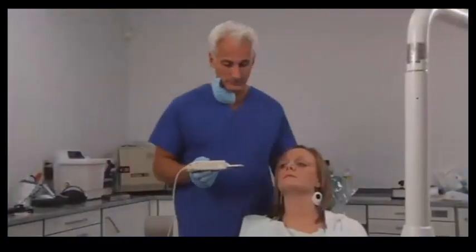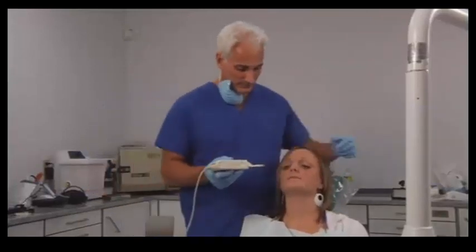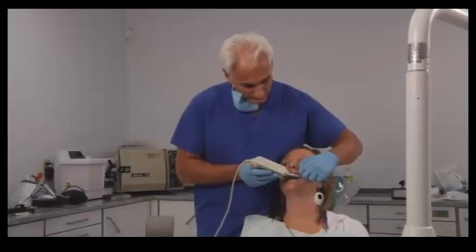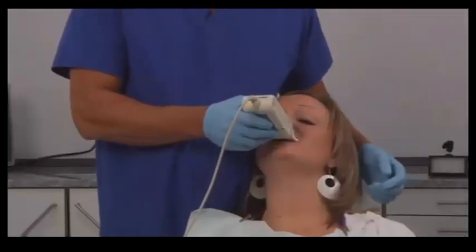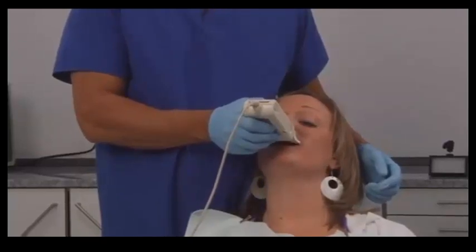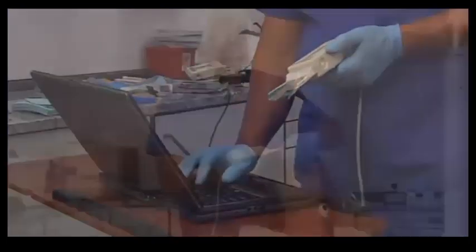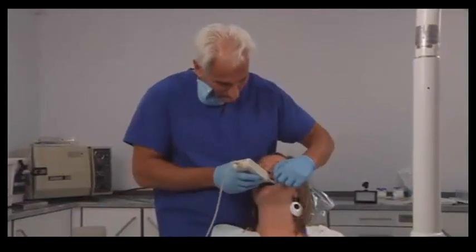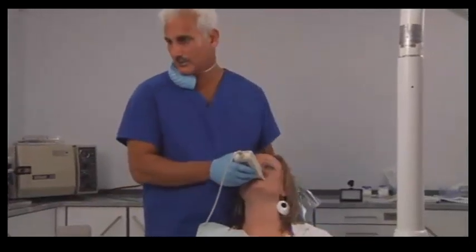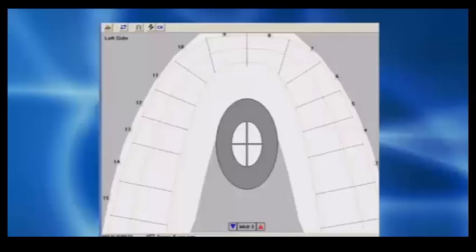Okay, Carolyn, we're going to re-record now, going right, left, and forward. Okay, put your head back. This will be to the right. Go ahead and bite down again. There we go. Open. Bite down again. Now go to the right. Good. Excellent. Okay, this time you're going to go to the left. Go ahead and bite down. Good. Open. Bite down again. Stay there. Now go left. Good.